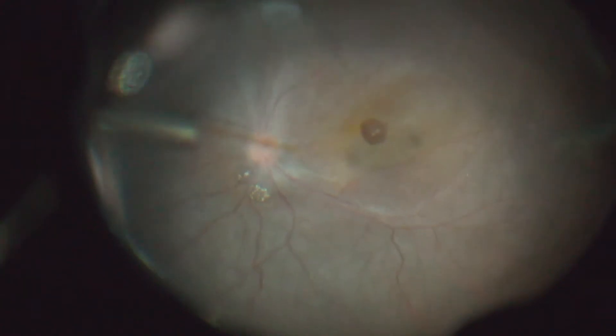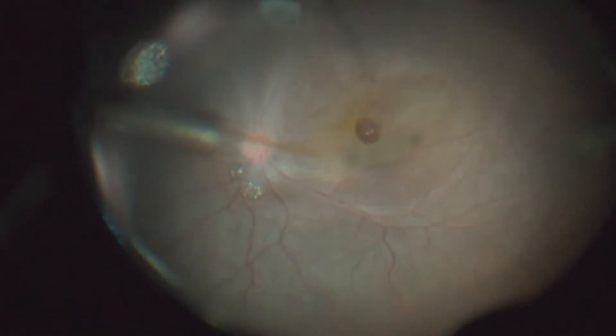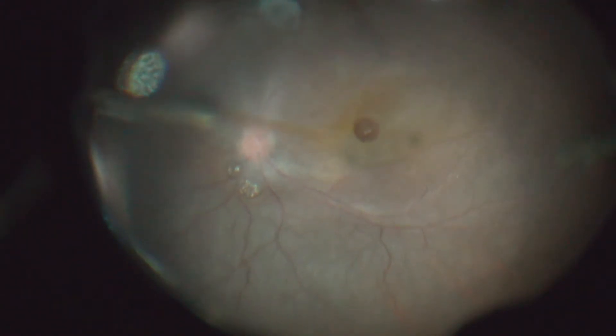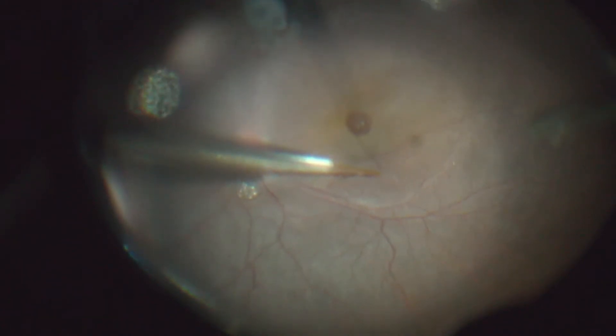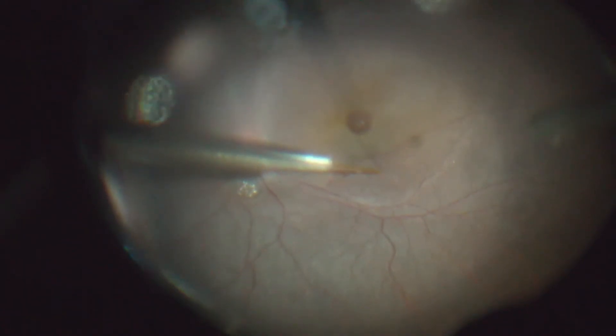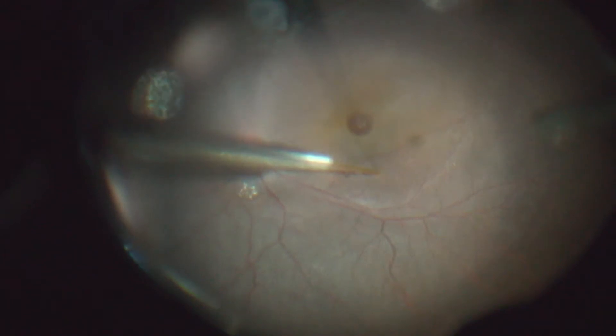I'm doing this slowly and in multiple sites to avoid inducing a macular hole, because the roof of this bubble is very thin.